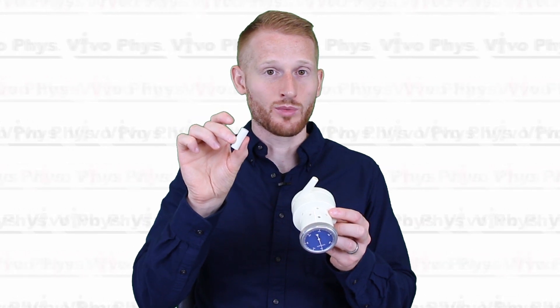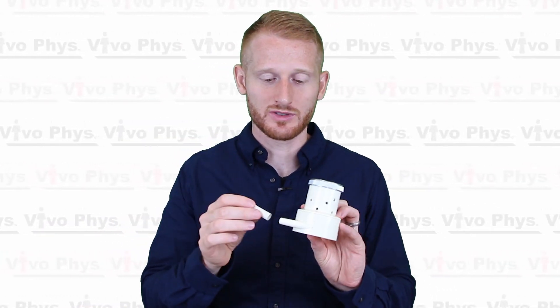Before you use one of these, you want to make sure that you either clean the mouthpiece — this little white tube — with some alcohol swabs or something else, or at least use one of these cardboard tubes that are sort of one person per tube, one-time use tubing.